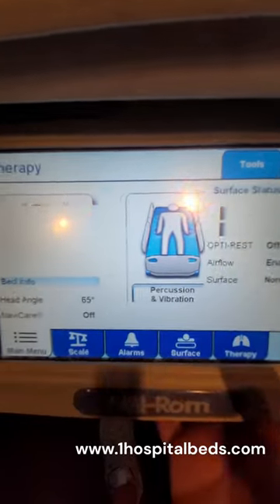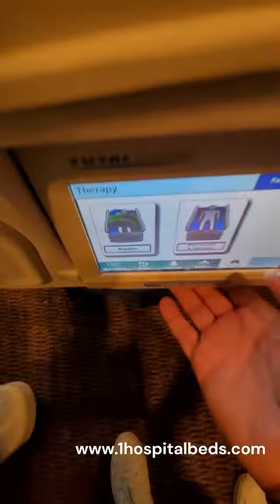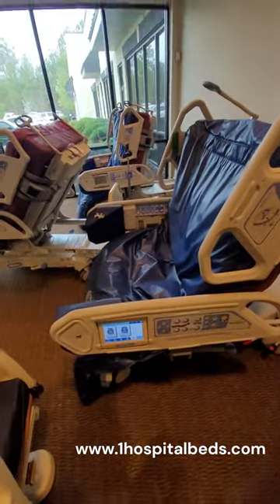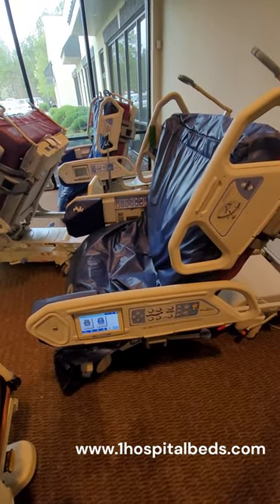So you have percussion vibration. We go back here to therapy, and it'll also turn the person. So if you're looking for a hospital bed that sits fully into a chair and has a percussion feature, these Total Care beds are your best.